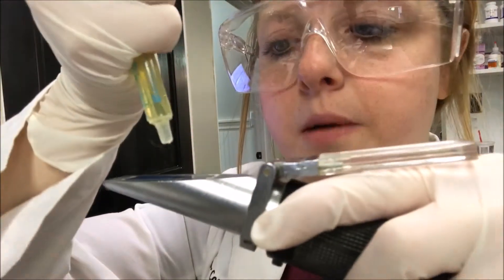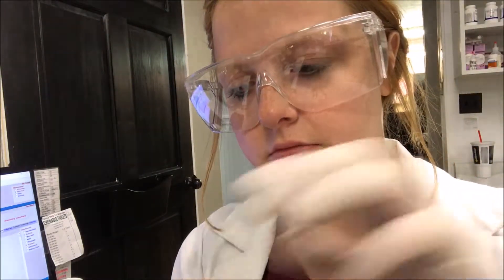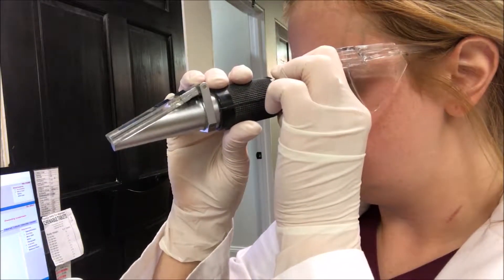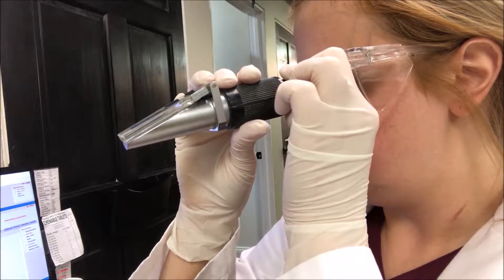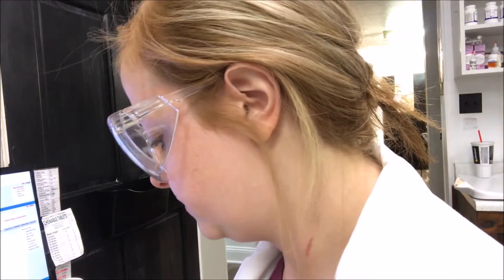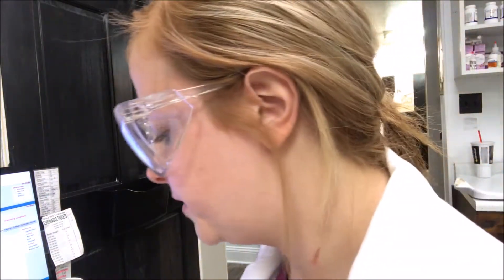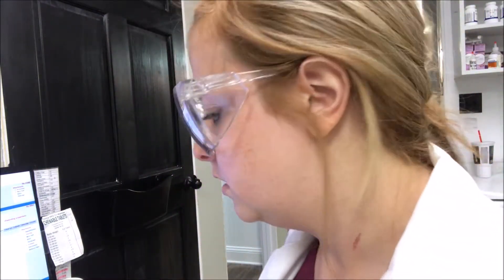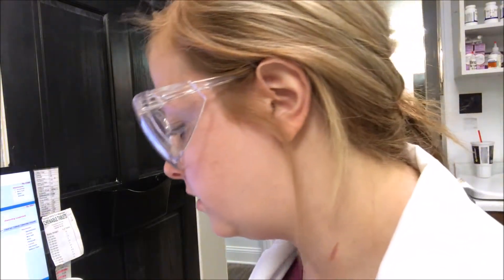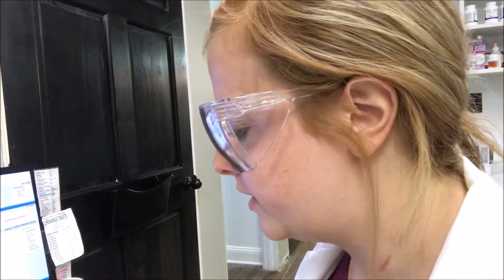Now we're going to look under the refractometer for the specific gravity. I'm going to put a drop of urine on it and look — it's about 1.039. No blood. The urine has a strong urine odor and there is no foam.